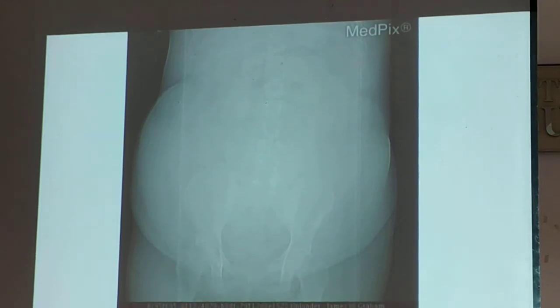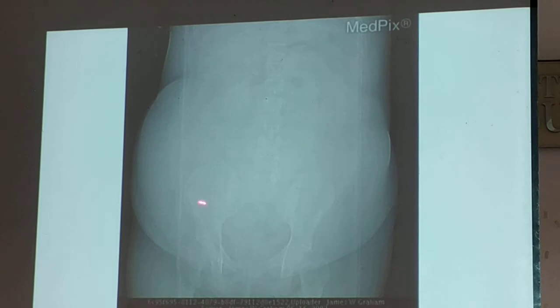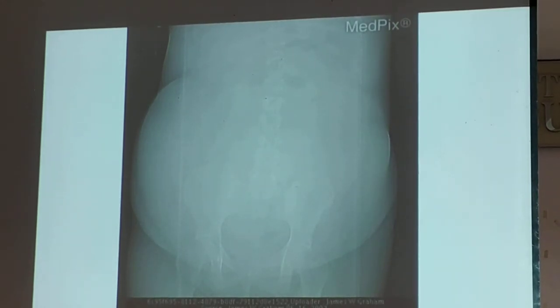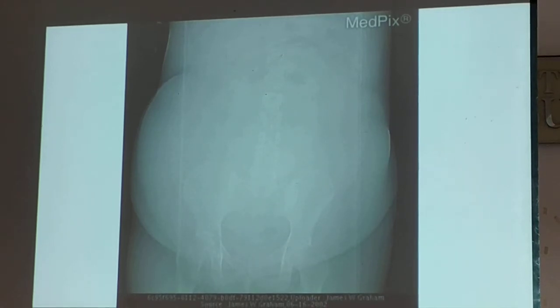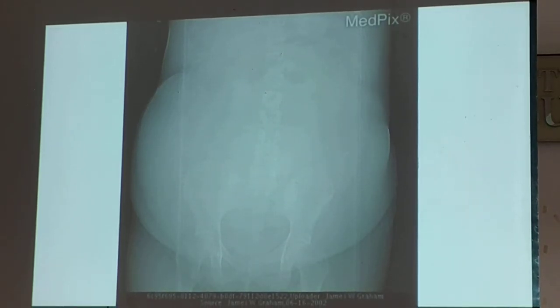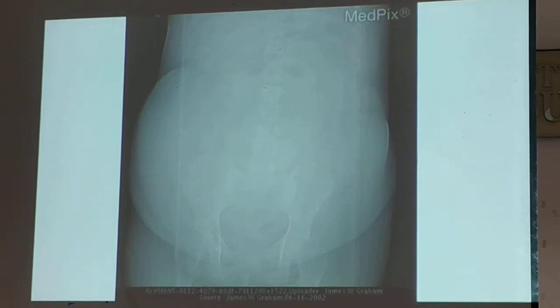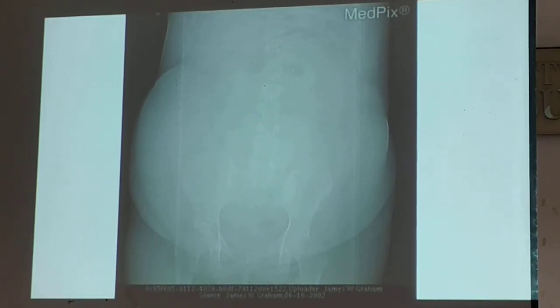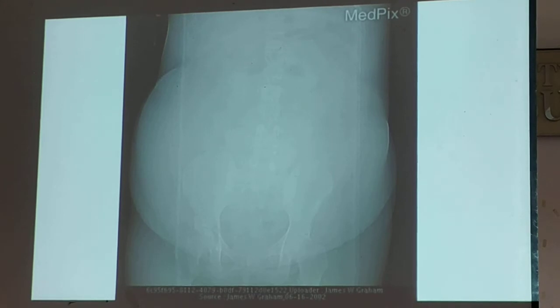This is your ascites: groundglass appearance and pouting of the flanks. Management of ascites? Some would give diuretics; if it does not respond, and the patient needs drainage.